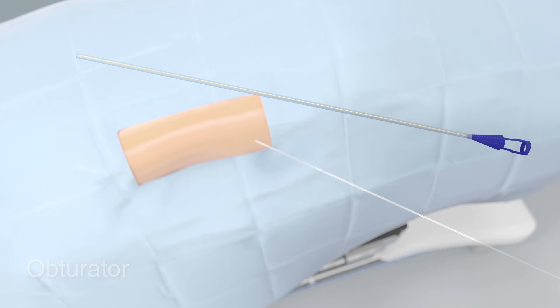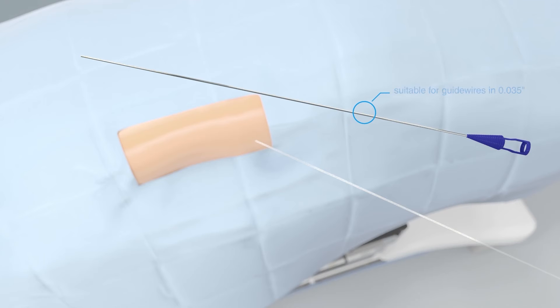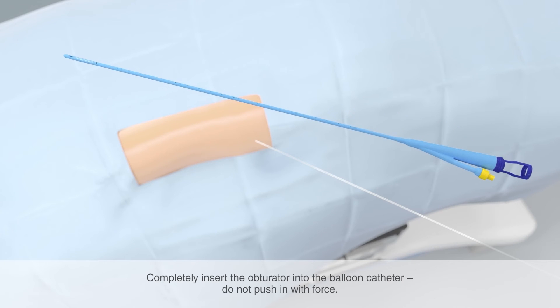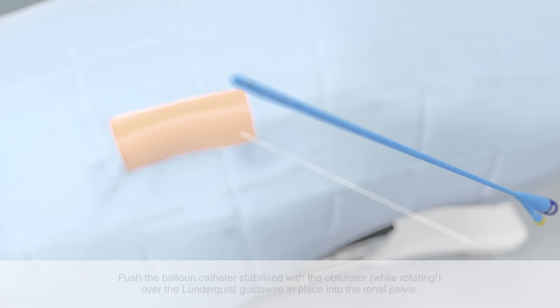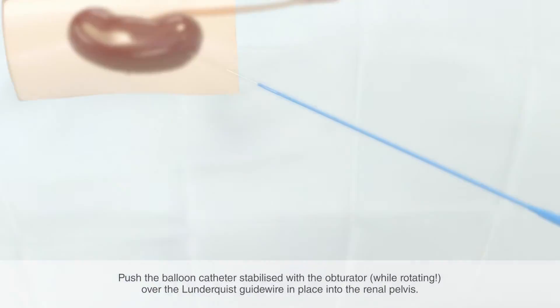The obturator included in this set serves as a stabilizer for the catheter during placement. Remove the protective tube. The obturator is suitable for guide wires of 0.035 inches. Insert the obturator into the funnel attachment of the NephroQuick balloon catheter. Push the obturator completely into the catheter and fix it with the connector to the catheter funnel — do not push in with force. The catheter tip, reinforced with a safety ring, ensures that the obturator cannot be pushed out through the end of the catheter. Push the balloon catheter stabilized with the obturator over the guide wire while rotating until it is in the renal pelvis.